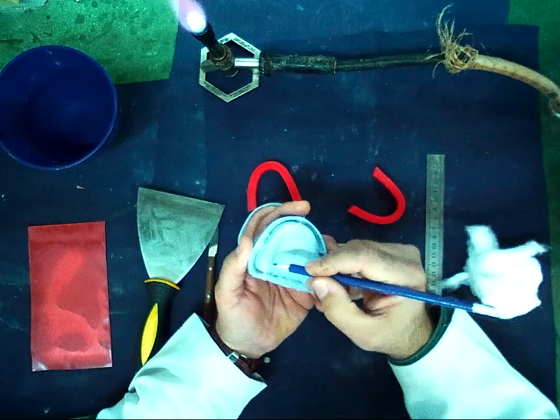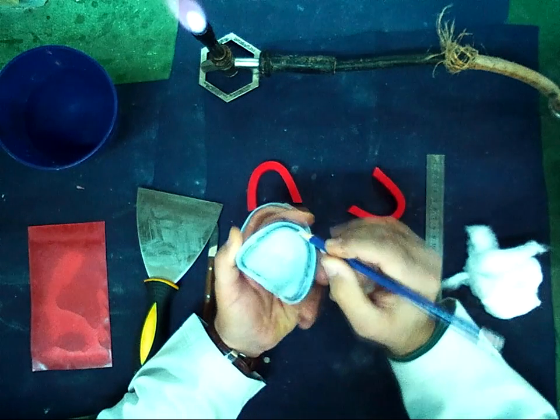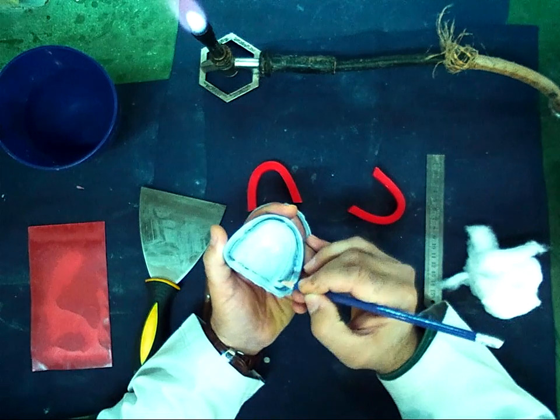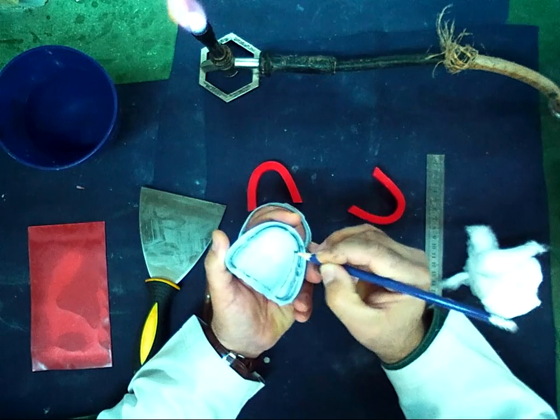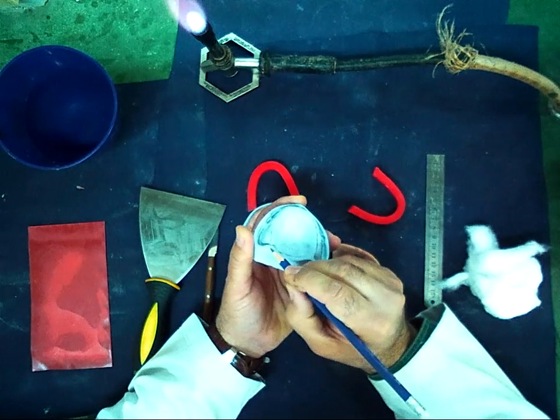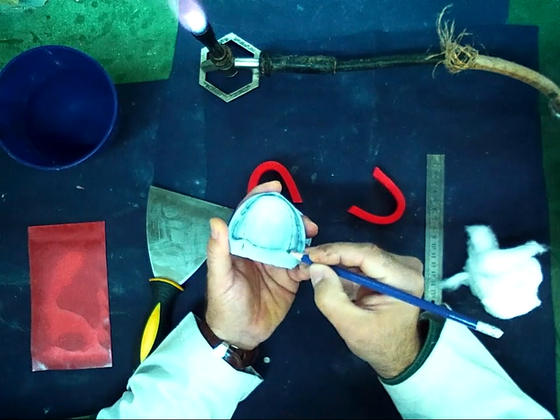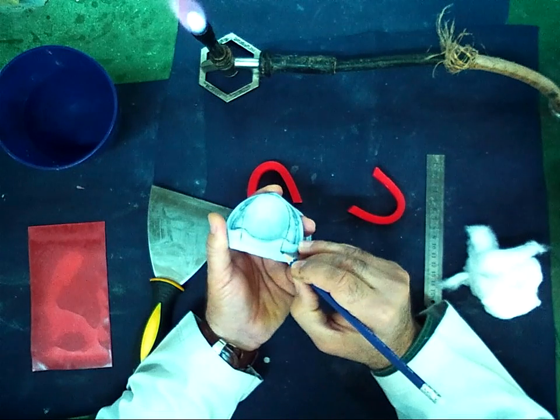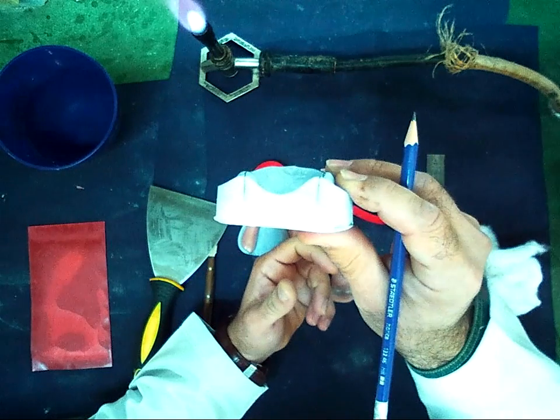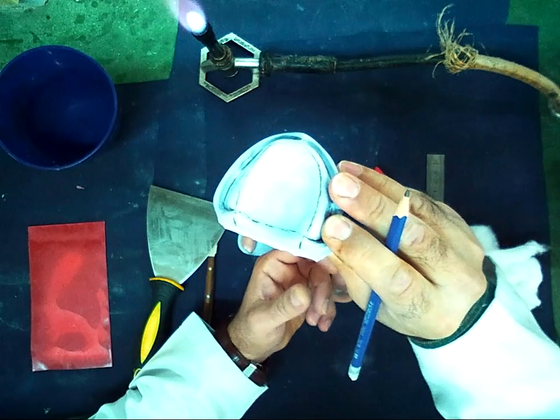The first line, I must draw a line bisecting the alveolar ridge in the center of the alveolar ridge, and continue this line to the posterior part of the cast, in the middle of the alveolar ridge. This is the first line.